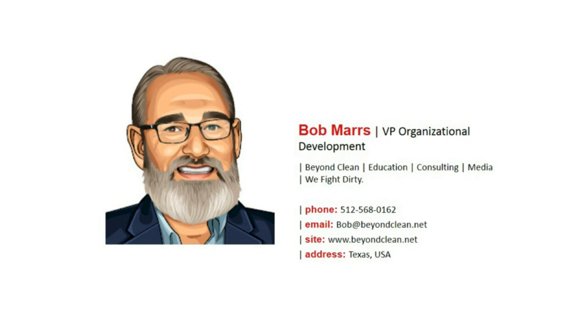All right, thank you. And Matt, I'm going to throw another one your way. There must be another way to process equipment, is this comment. Can you address this? Well, yeah, I think we come across a lot of people that say, well, there must be another way to do it. Unfortunately, there are other methods with steam or UV light to sterilize equipment, but this specific equipment that's being reprocessed is going to need some sort of chemical sterilant. So at the end of the day, they're all biocides that are meant to kill all life. Otherwise, this equipment that's going into people's bodies or being used in surgery could possibly give these people an infection, or cause death that way.